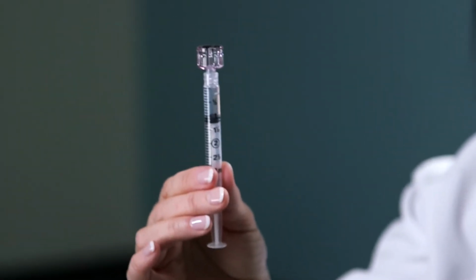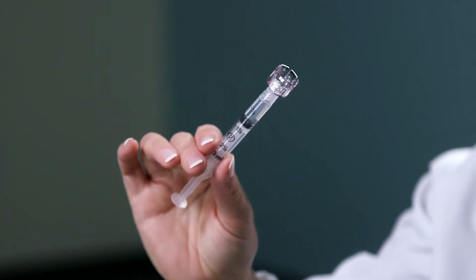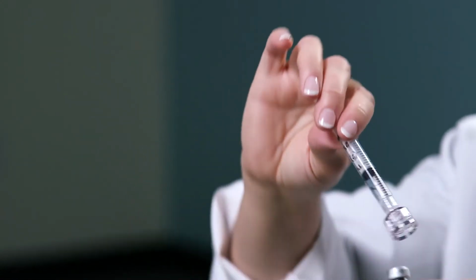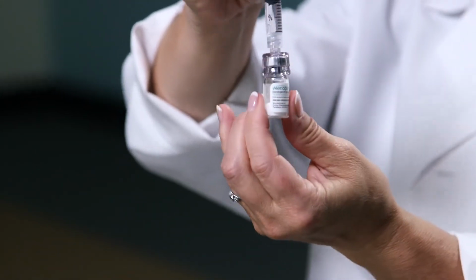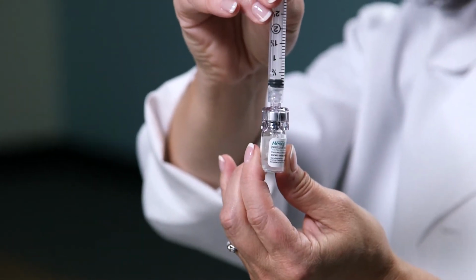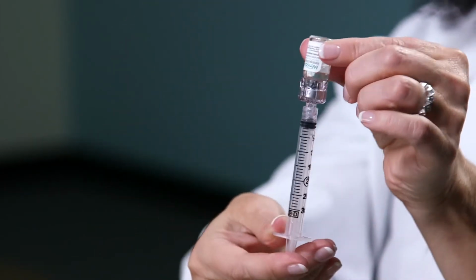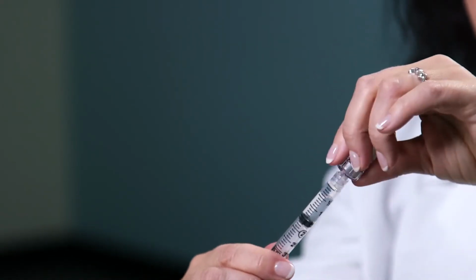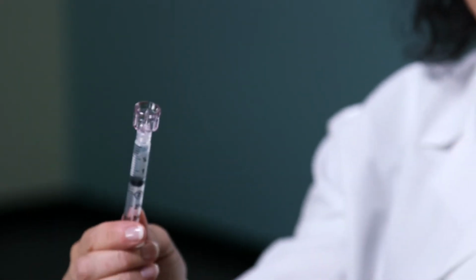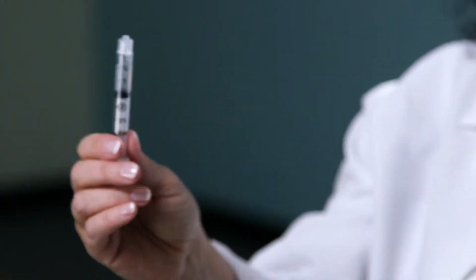Pull the syringe and Q-cap off of the vial, holding onto the barrel of the syringe. And then take your Menopur vial and just snap the Q-cap on top of the Menopur vial. Press down on the plunger to expel the sodium chloride into the powder. Turn it around and draw it all back out. Unscrew the Q-cap and discard in a sharps container.